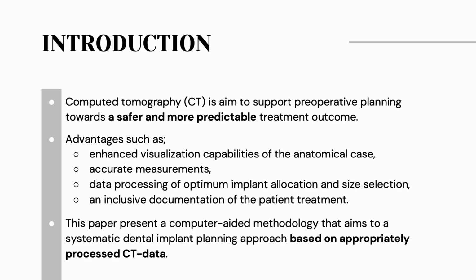The introduction. Computed tomography is aimed to support preoperative planning towards a safer and more predictable treatment outcome. There are advantages such as enhanced visualization capabilities of the anatomical case, accurate measurements, data processing of optimum implant allocation and size selection, and inclusive documentation of the patient treatment.